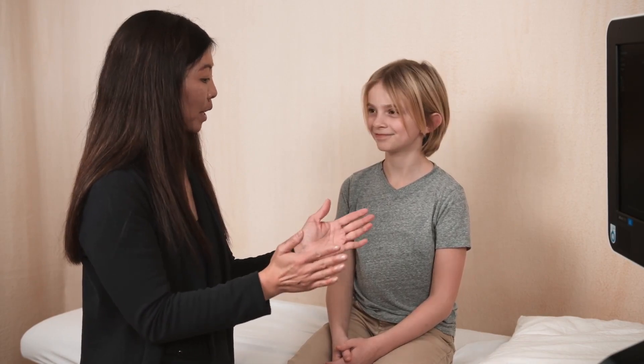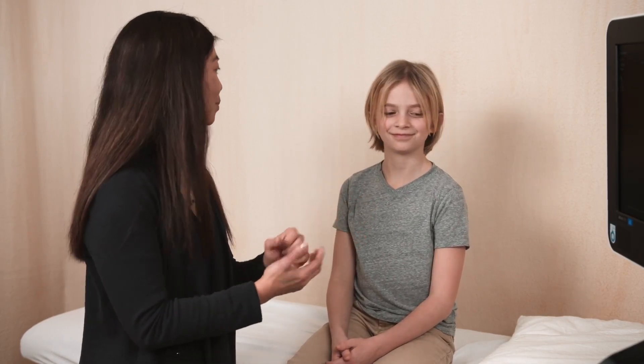The first step of any paediatric echocardiogram is to ensure that you talk to the family and talk to the patient. This is a very important step because it allows you to develop some rapport with the patient and to allow the child to feel at ease with the study and the exam. So Lucas, today what we're going to do is take some special pictures with a camera so that I can look at your heart — how it is functioning and how it is put together.